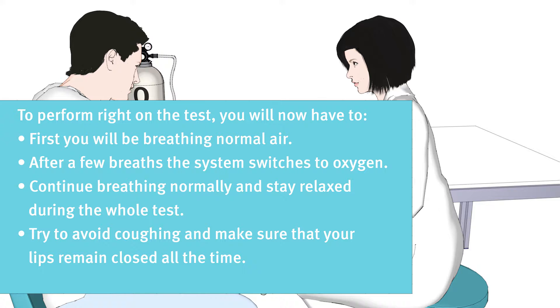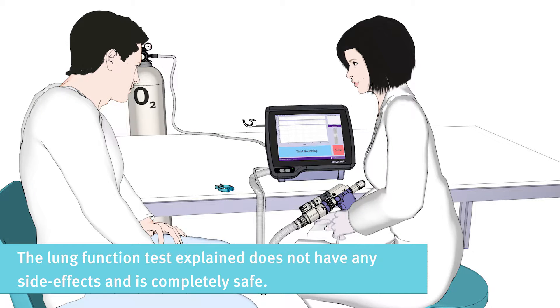Try to avoid coughing and make sure that your lips remain closed at all times. The test will take around three minutes. The lung function test does not have any side effects and is completely safe.